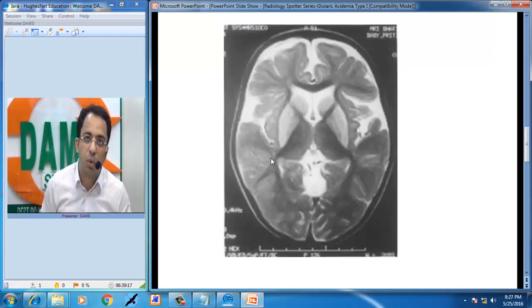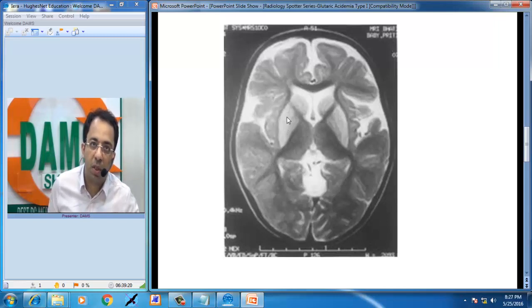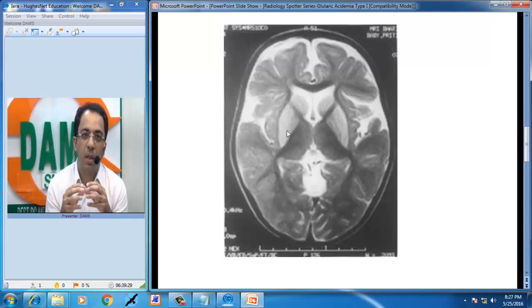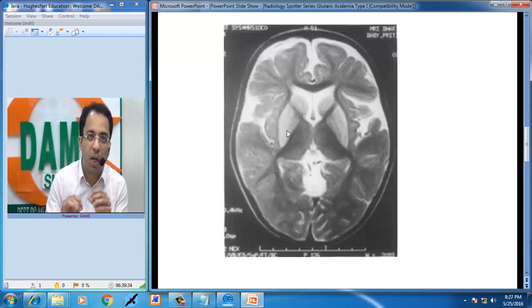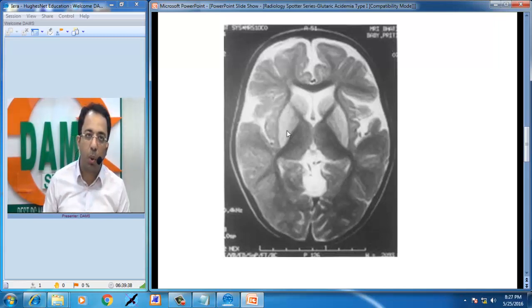On the T2-weighted image in this patient, you will see high signal intensity in the caudate nucleus and lentiform nucleus — so you have high signal intensity in the basal ganglia — and opened-up Sylvian fissures with lack of opercularization of the insular cortex.